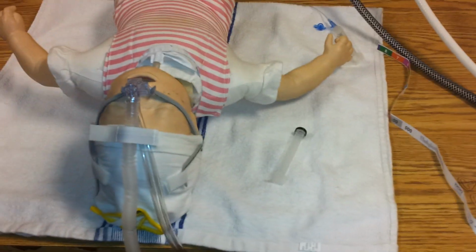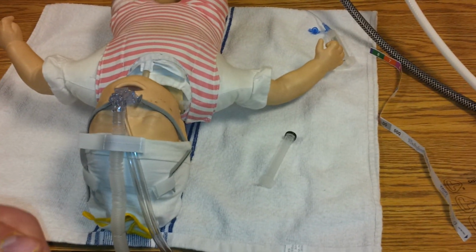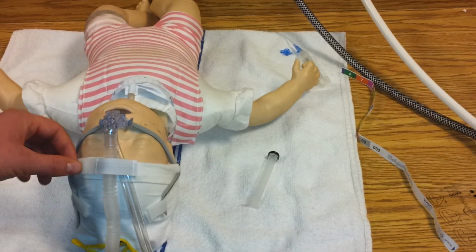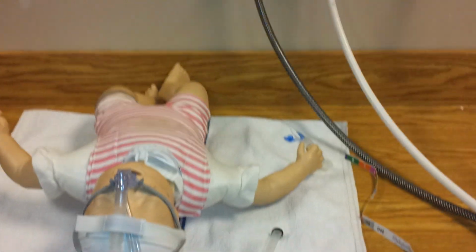So once you do hook up the baby to this, you want to do a quick little ABC and make sure you're getting good air entry, stuff like that. Make sure they're tolerating the treatment.